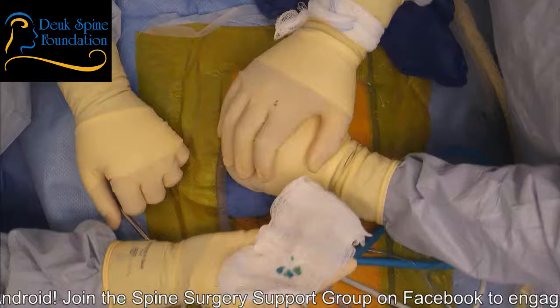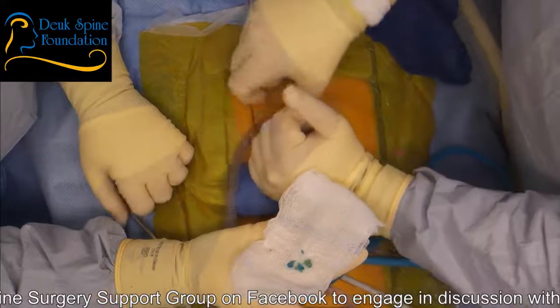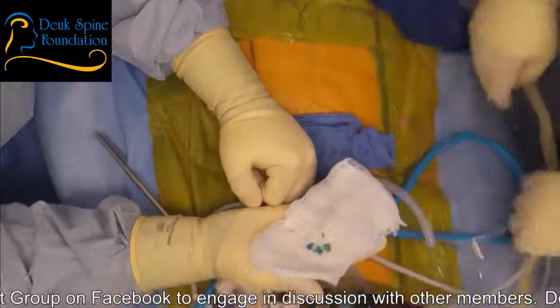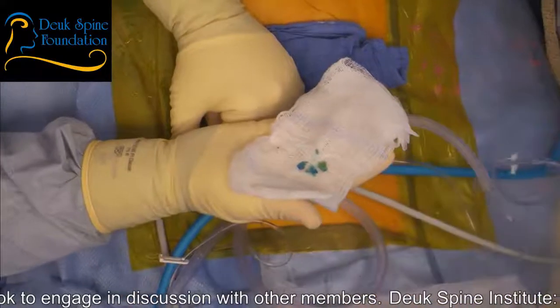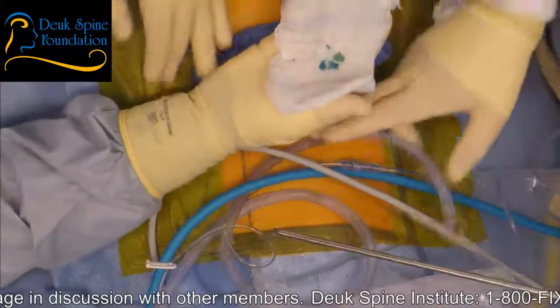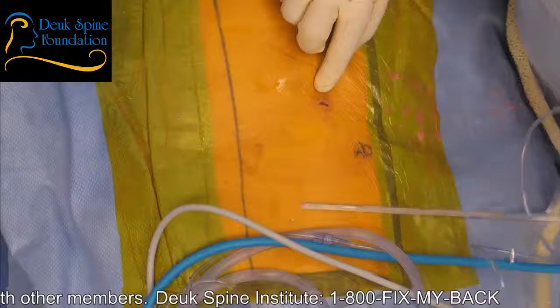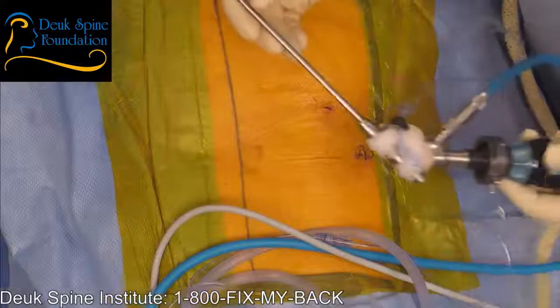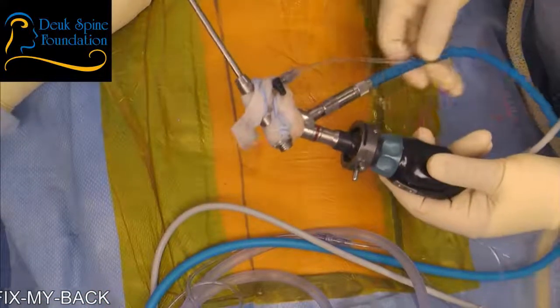All right, let's look at some of the pieces of herniation we took out. Sean, you want to bring the camera in? Yes, we see them. All right, so these, we didn't get all the herniations because a lot of it leaked out into this bag down there, but we saved a few, you know, just for memorabilia sake, right? All right. Let me show you the incision. Move your hand, please. The whole surgery was done through this incision right there. Okay? Just to give you an idea, that's 7 millimeters. It's tiny. This patient will go home in about an hour, and they'll be recovered in an hour. Okay? And this is the scope that we use with a camera, light source, irrigation.